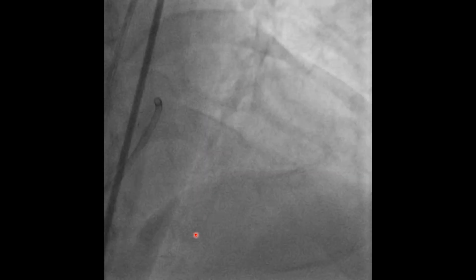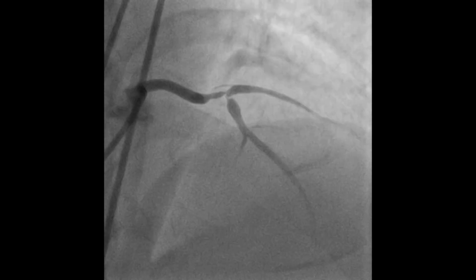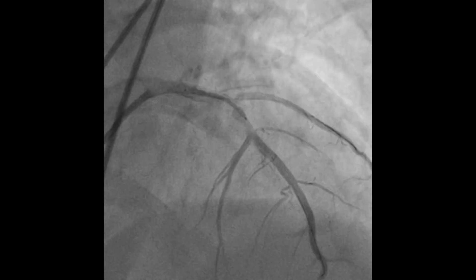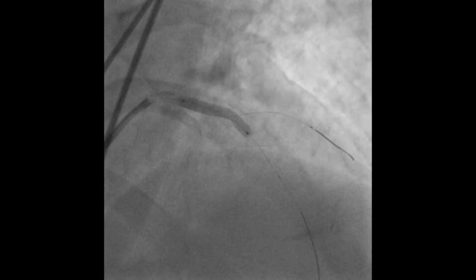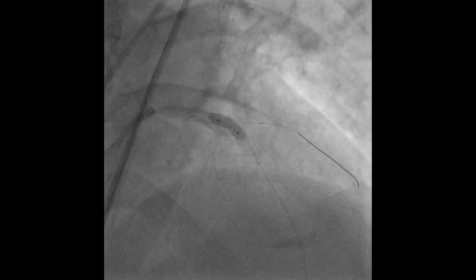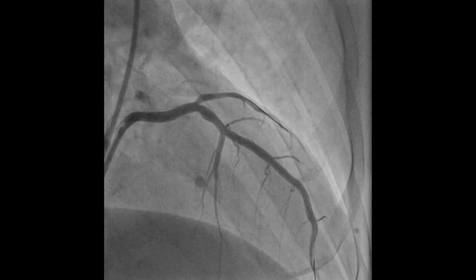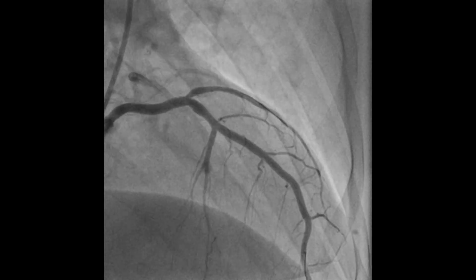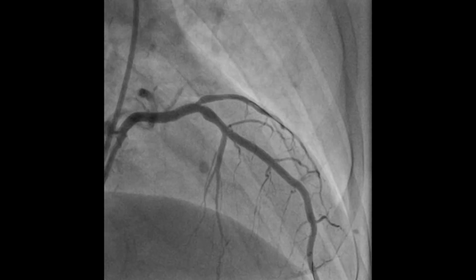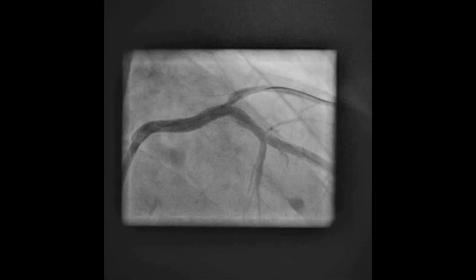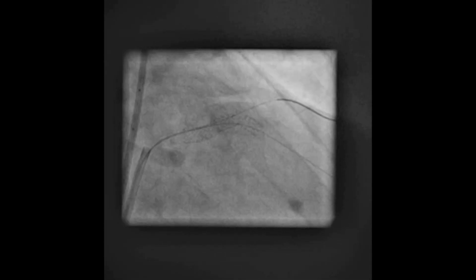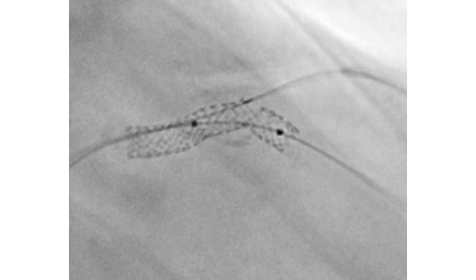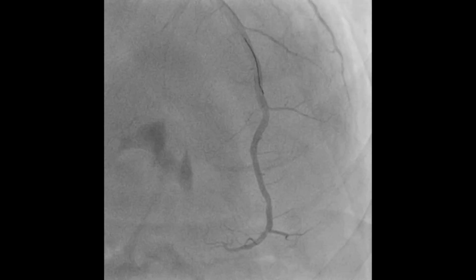In another case, there was a bifurcation lesion in the proximal LAD with a band. Pre-dilatation was done, a stent was positioned and deployed, then post-dilated with an NC balloon to high pressure. This showed some narrowing at part of the stent. Further dilatation was done, and with every dilatation, recoil happened into the stent. Stent enhancement was used and showed fracture of the stent — actually a near-complete dehiscence. So a smaller stent was used, and the result was okay.